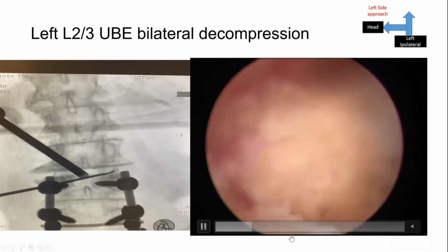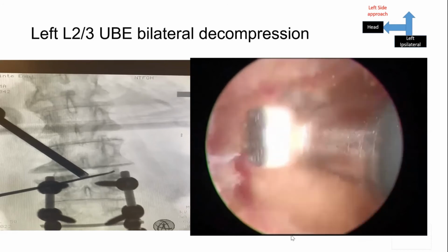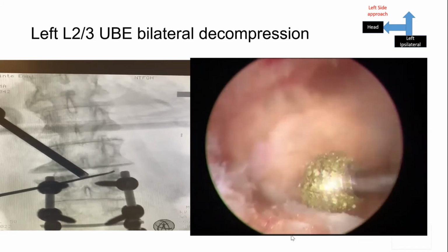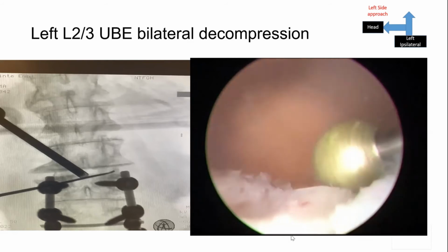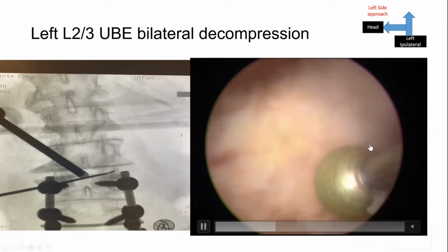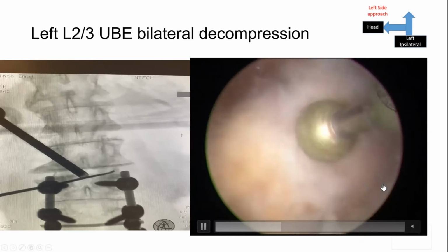You can see there's very little scar even in a so-called revision surgery, although she had an open laminectomy and fusion, so the scar in the skin and subcutaneous tissue is significant. But in UBE, because we work directly on the bone, as long as the lamina of the distal junction, as you can see here, is preserved, then you can just do it like a primary surgery.